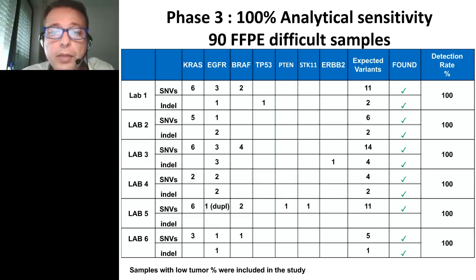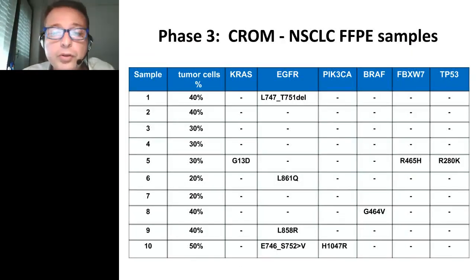In fact, by using the panel, we identified among these 10 samples 4 EGFR mutant, 1 KRAS mutant, and 1 BRAF mutant. So we could classify 6 out of 10 of these tumors in already known subgroups, defining the molecular-defined subgroups of lung carcinoma. However, we also obtained information on tumor heterogeneity.